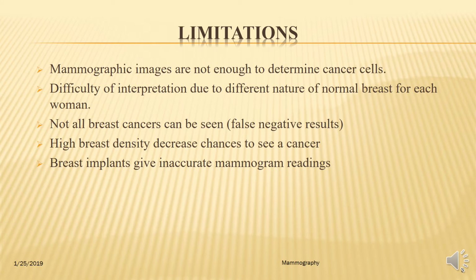There are limitations on the device. Initial mammographic images themselves are not usually enough to detect the existence of a benign or malignant disease with certainty. If a finding or spot seems suspicious, your radiologist may recommend further diagnostic studies.